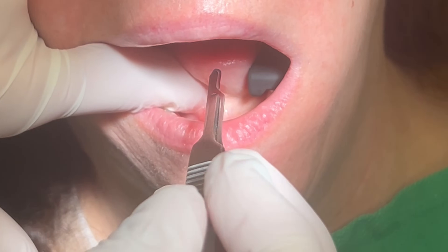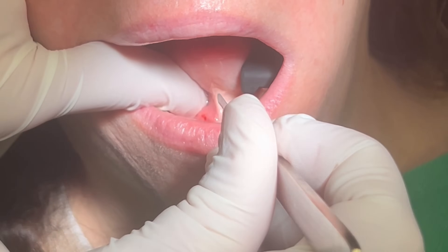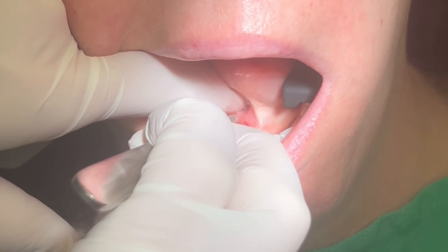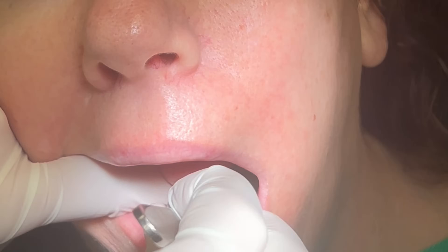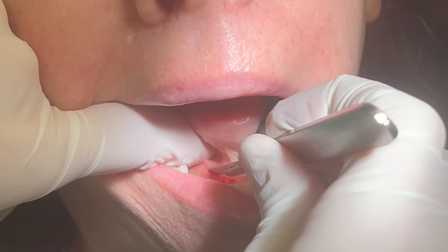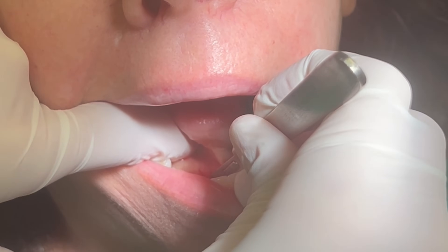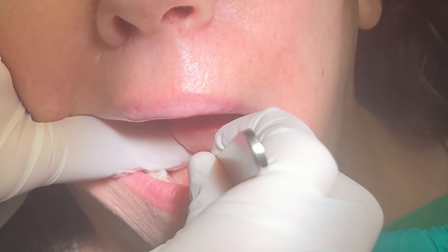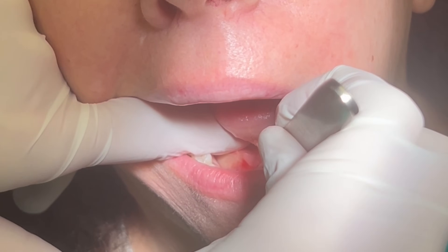Once the area is numb, I make an incision in the floor of the mouth right where I feel the stone. It is so important to keep my finger proximal to the stone so it doesn't fall deeper into the duct while I'm trying to remove it.